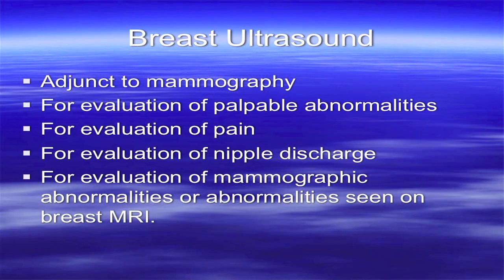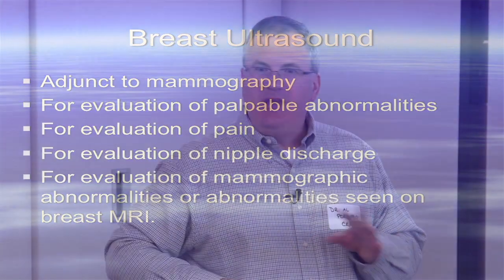Okay, so breast ultrasound, we'll go through quickly. It's an adjunct to mammography. I don't have an opinion one way or the other. If that's what the woman is comfortable having and that's what their doctor wants her to have, that's what we do. I'm not an advocate for it because you don't see calcifications and there are some things that might be hard to find because we're just kind of looking throughout the whole breast and we're not exactly sure if there's an area we should be more attentive to.